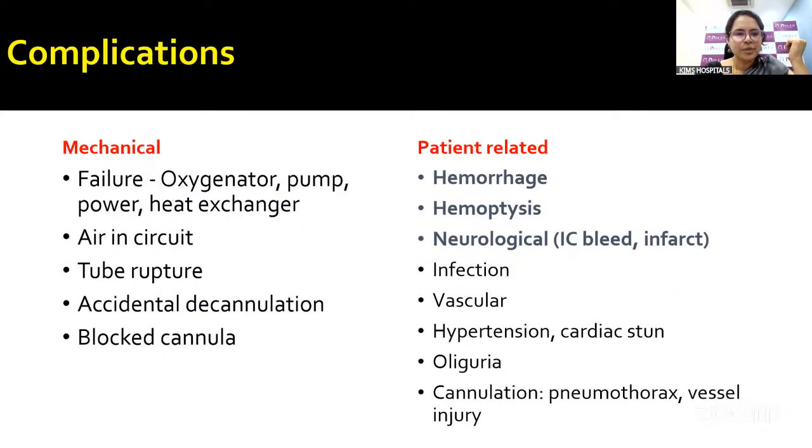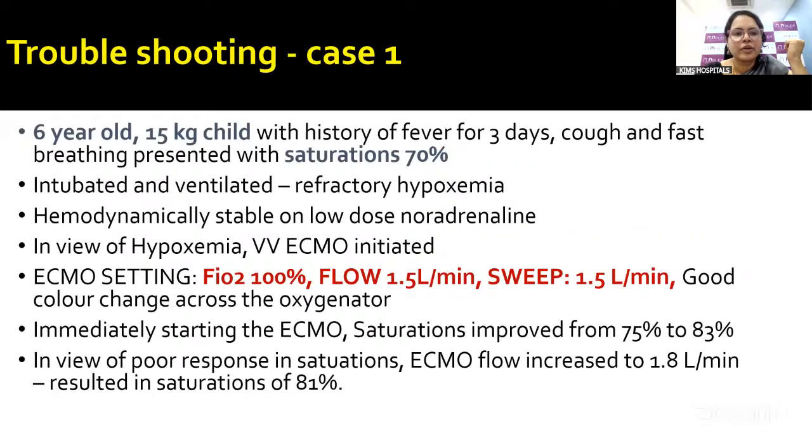So I'll just finish by discussing one brief troubleshooting case. This case is given to me by Dr. Kalyan from our PSU team. Thanks to him. So this is a 6-year-old child, 15 kgs, with history of a fever for 3 days and cough and fast breathing, and presented with low saturations.